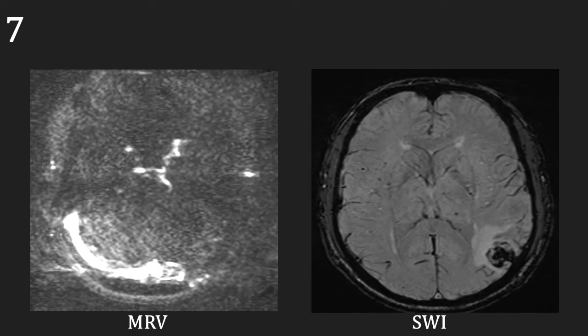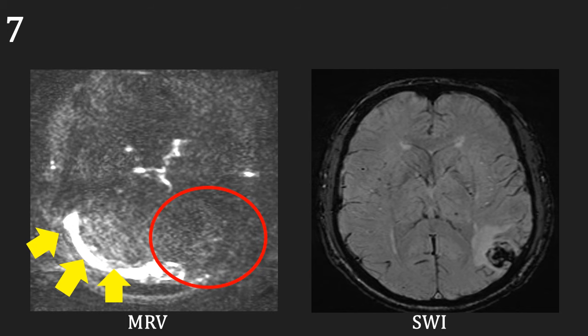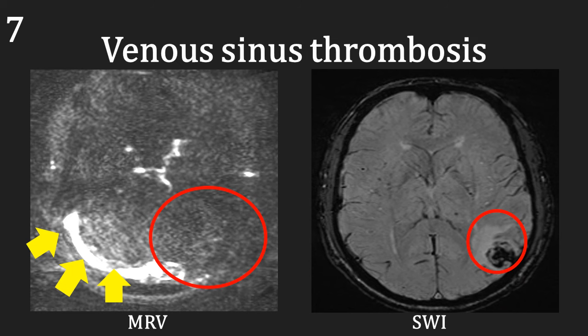Our next case is a 50-year-old male who presented with sudden onset confusion and difficulty finding the right words. On the venogram, we can see the normal right-sided transverse venous sinuses highlighted by the yellow arrows. However, this is missing on the patient's left, in keeping with venous sinus thrombosis. In addition, on the SWI sequence, we can see an area of low signal abnormality adjacent to the transverse sinus, indicating a bleed associated with this thrombus. This is a venous sinus thrombosis complicated by parenchymal haemorrhage.